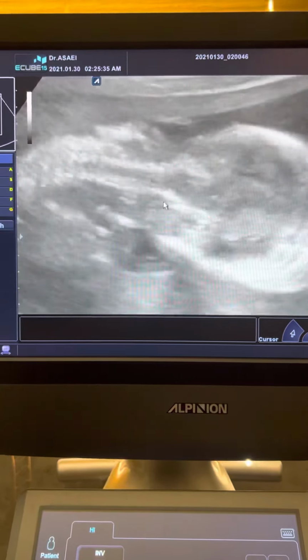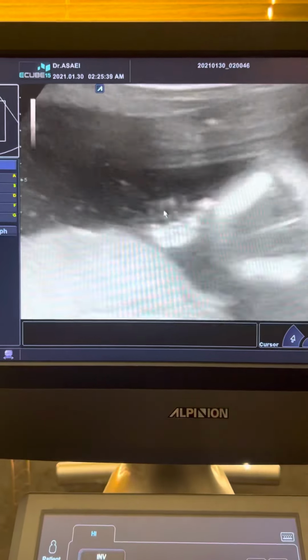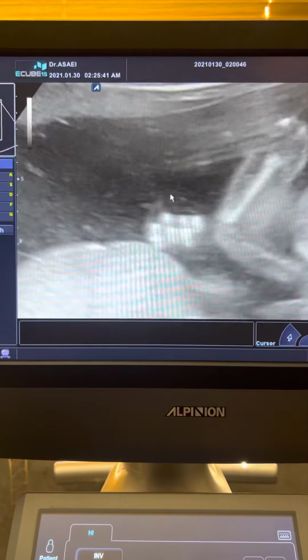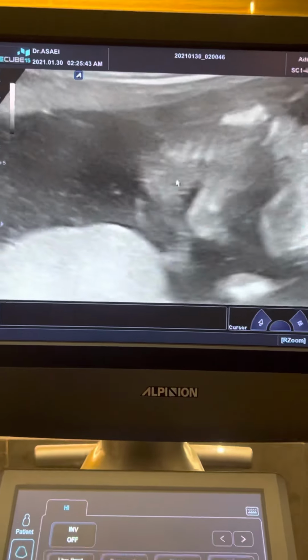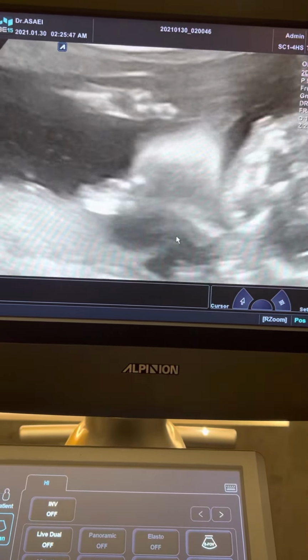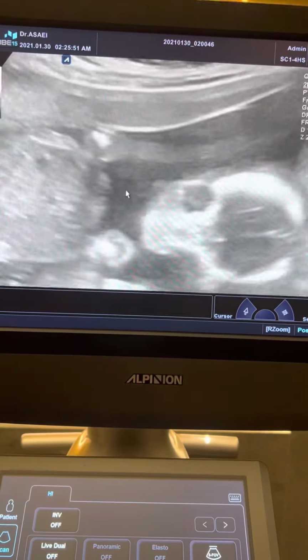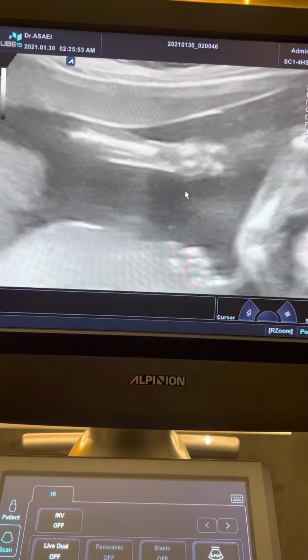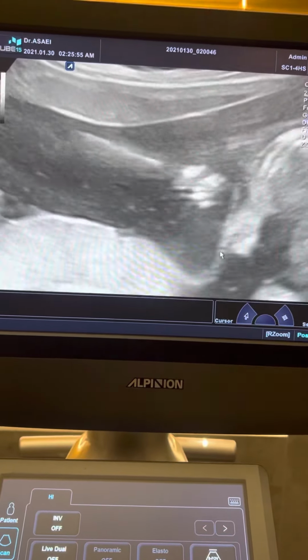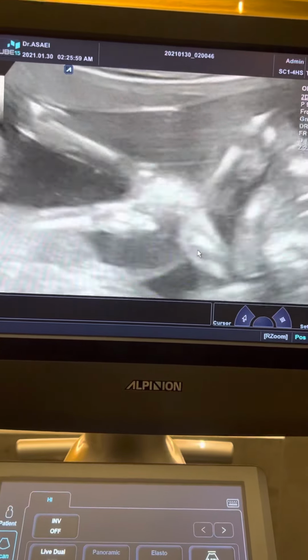See, this is not the hand of fetus B, these two. Here we have the hand. See, the membrane is moving here, the hand. These are the hands of fetus A we have checked. So this is the membrane. It cannot come to the sac of the fetus B.